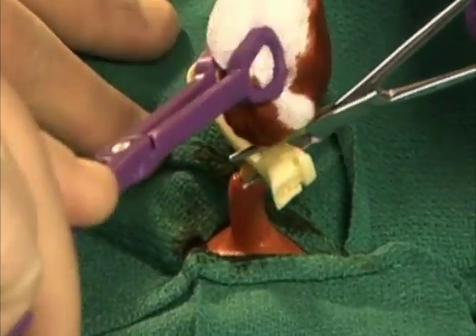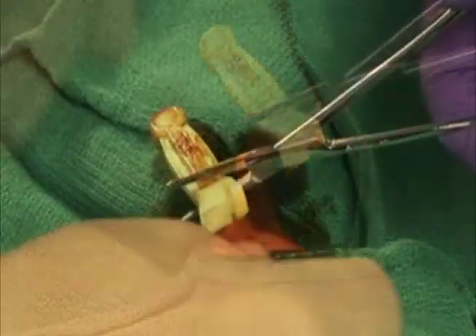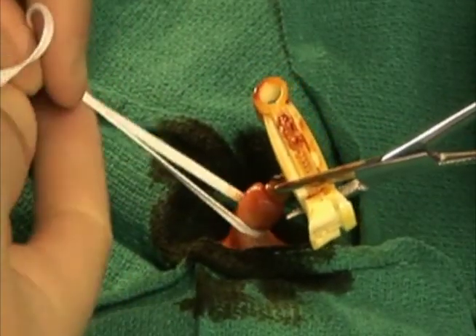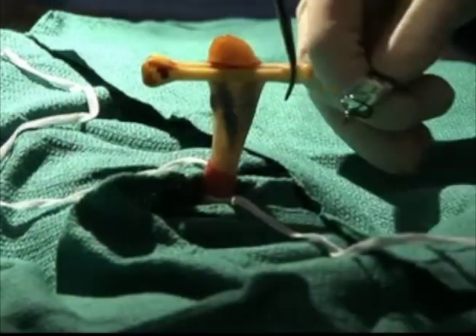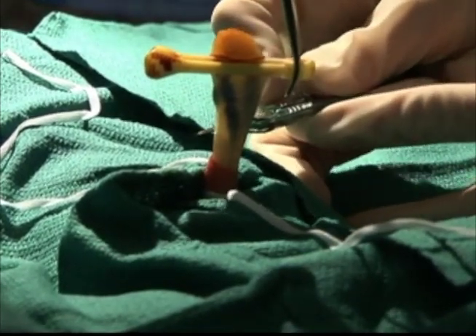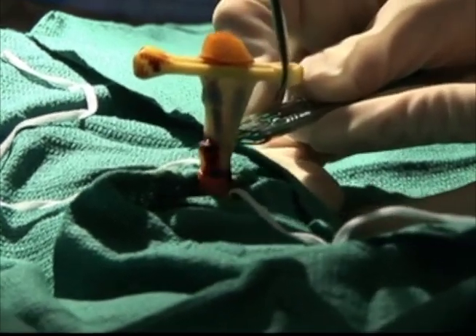Apply sterile towels or surgical drape in such a way that the patient's face is visible, then wrap the cord tie around the base of the umbilicus and tie with a single knot. The knot should be tight enough to prevent bleeding from the cord, but loose enough to allow the catheters to pass through the vessels of the cord. Cut the cord horizontally with the scalpel, approximately 1.5 centimeters from the skin. Take care not to cut the skin that is at the base of the cord.